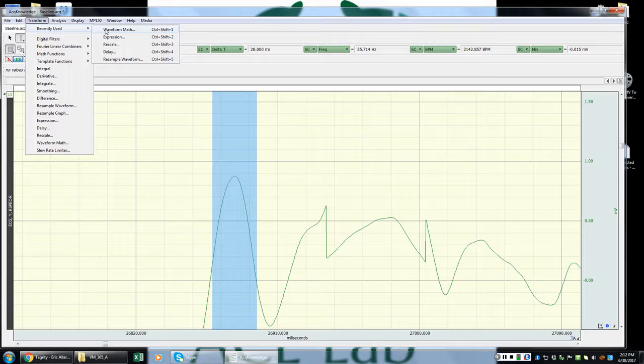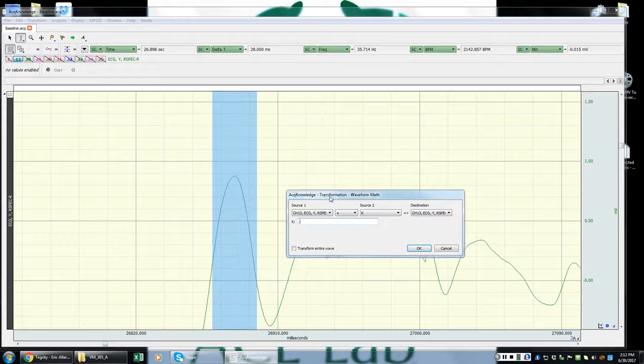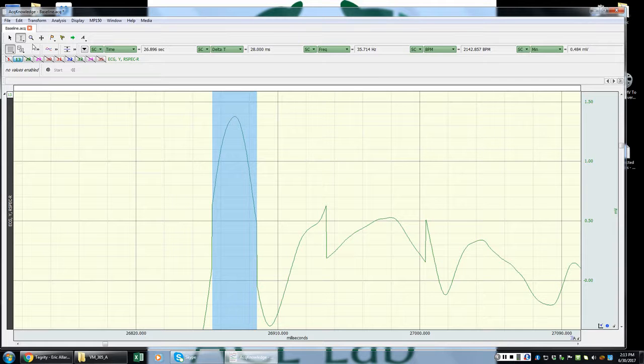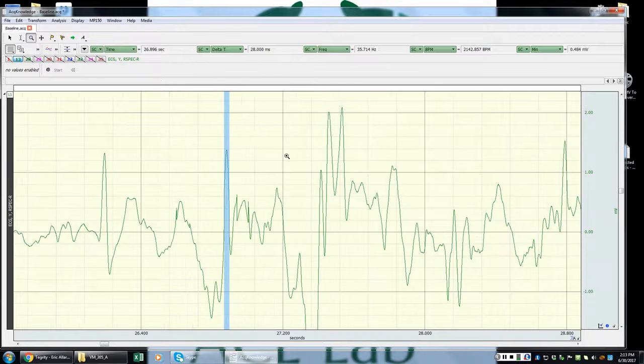Now I want to move this peak up a little bit. Okay, so I'm going to actually do the addition sign for this, and I'm going to go pretty small, all right, because adding actually jumps up quite considerably here. And if I do like a 0.5. Okay, and I'm going to zoom back just to see how high up that looks. Okay. And that looks pretty good, okay?